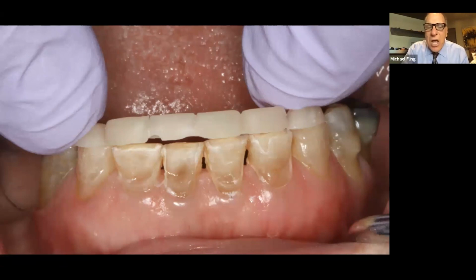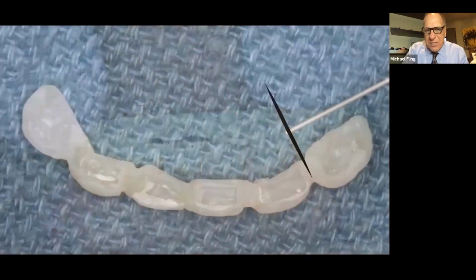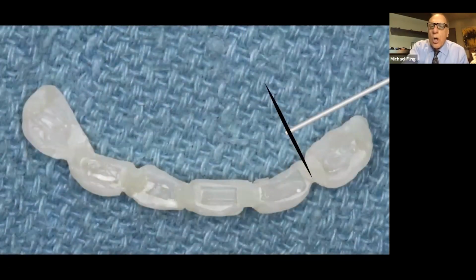After that is done, and you absolutely are sure you have it passively fitting in the position you want, you get an ultra-thin diamond disc. And what you do is you go in from the lingual. And here you see going into the lingual, you don't go all the way through. You leave this connected, and then you get your little fingers and you go snap, and you let this snap apart right here. And then you do the next one, and then the next one, and the next one, and the next one.